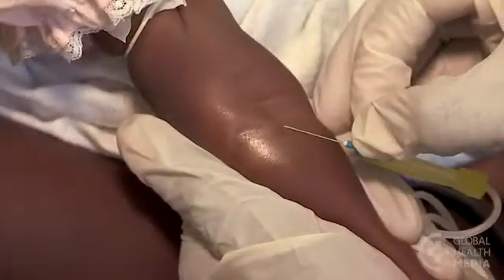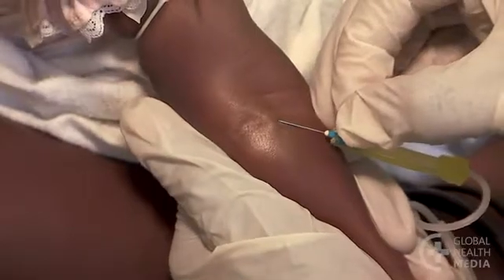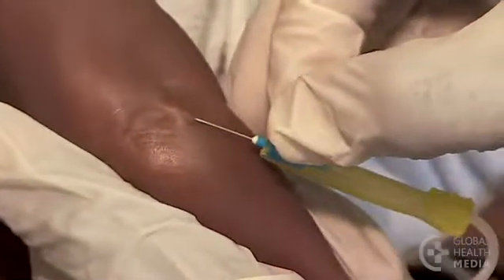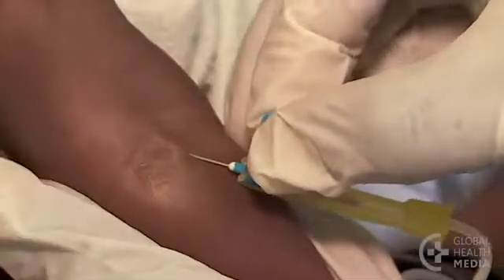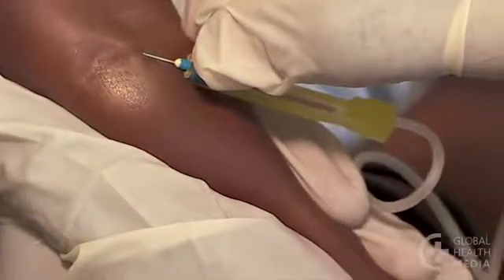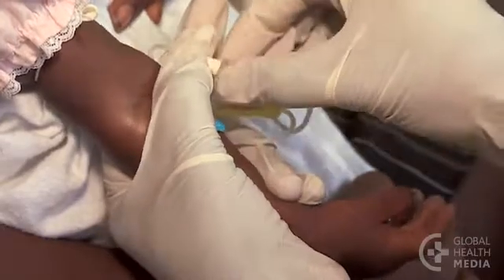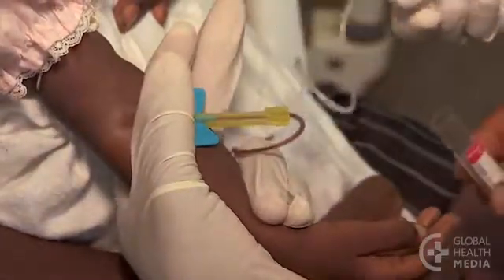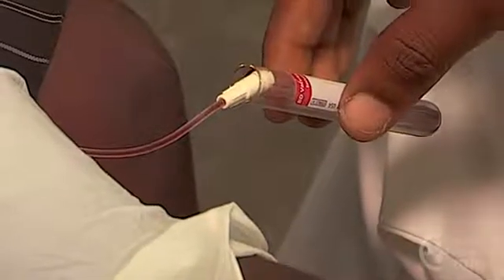Hold the skin firmly and insert the needle. Move the needle slightly until you see a flash of blood in the tube to show that you're in the vein. Uncap the end of the device to draw the blood into the tubing. It then drips into the tube.